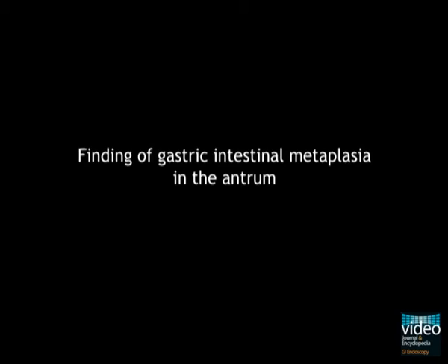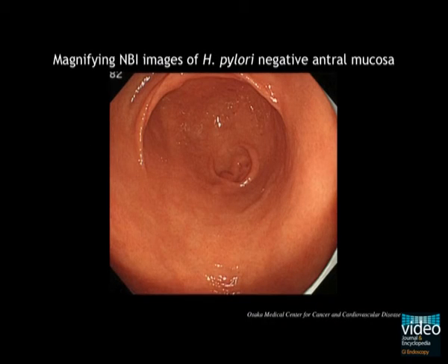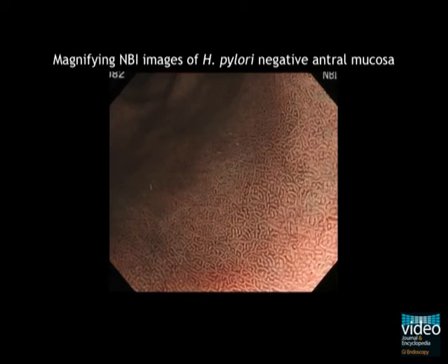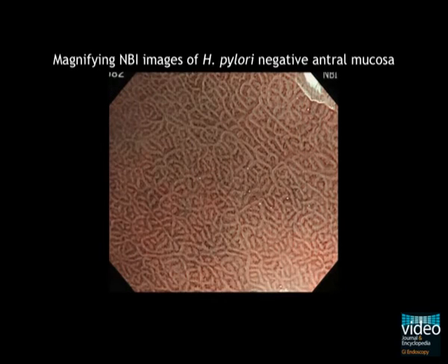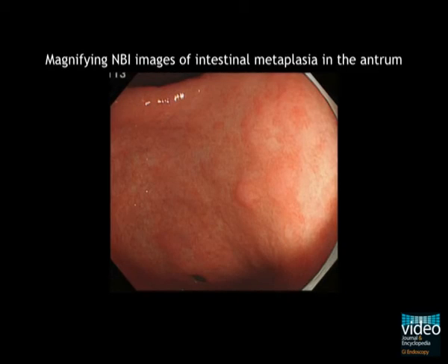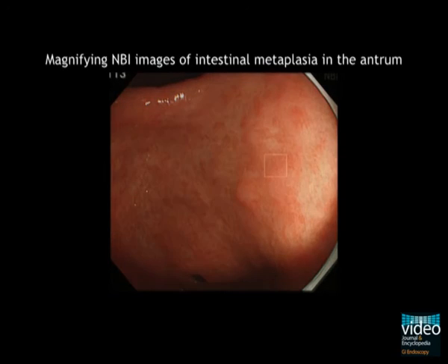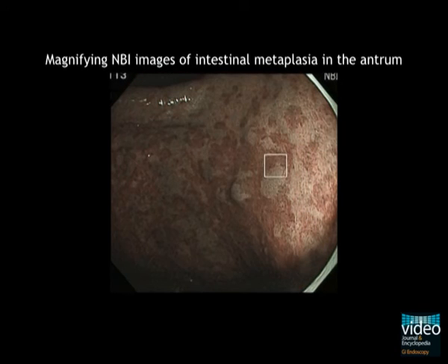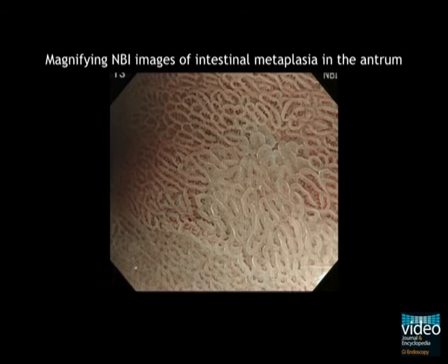The findings of gastric intestinal metaplasia in the antrum are now explained. In H. pylori negative patients, mucosa looks homogeneously reddish and smooth, and a regular groove-type mucosal pattern can be seen in NBI image. Whereas in patients with gastric intestinal metaplasia, mucosa has slightly whitish patchy areas and the surface is uneven. In NBI image, gastric intestinal metaplasia has whitish patchy areas. In magnifying NBI image, an area with intestinal metaplasia has a whitish papillary or villiform structure with the light blue crest on the surface.